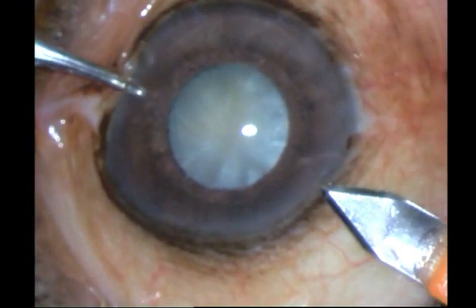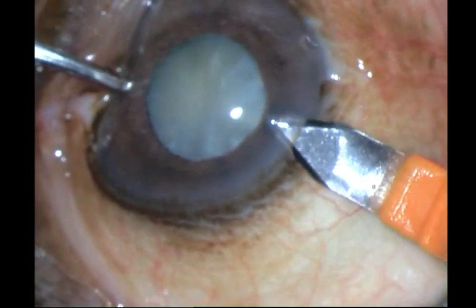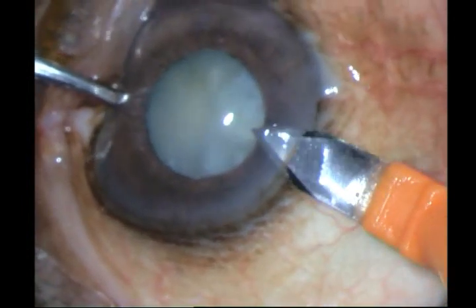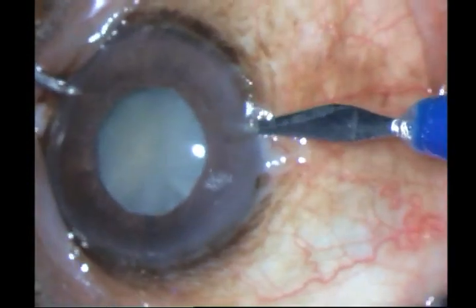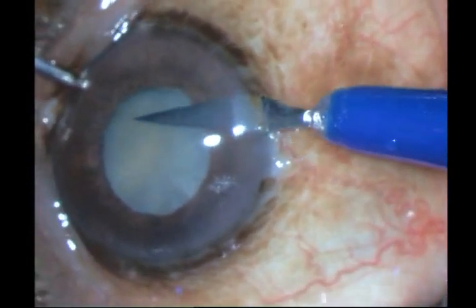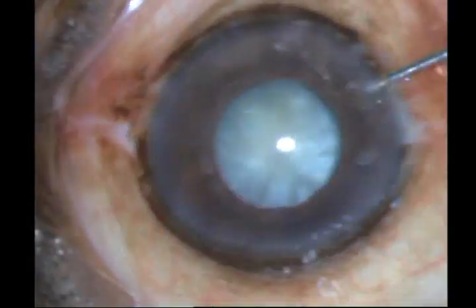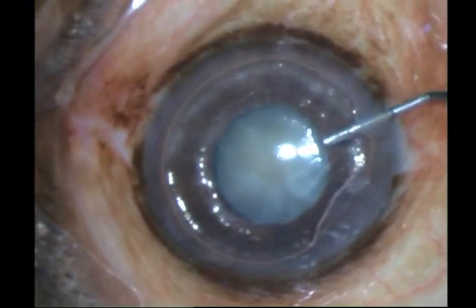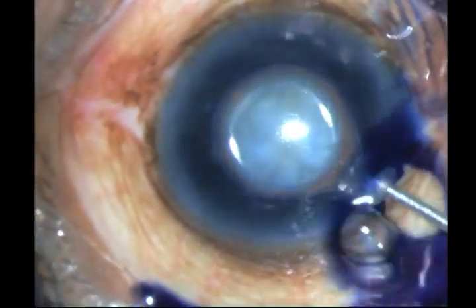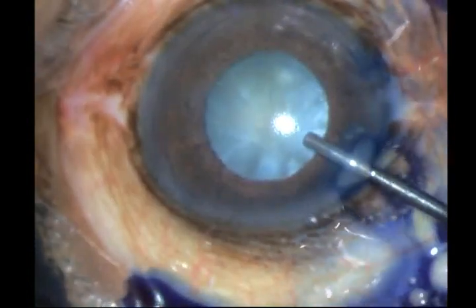I go ahead and place two side port incisions. Then under air, I stain the anterior capsule with trypan blue, and expel both the air and the trypan blue with two percent HPMC, just placing a bit of HPMC over the cornea as well.